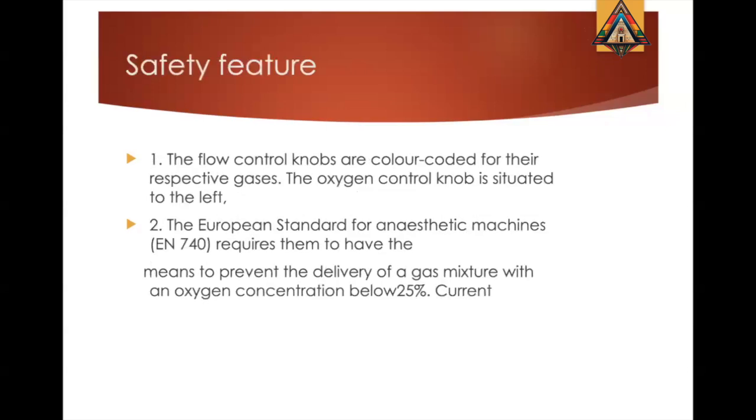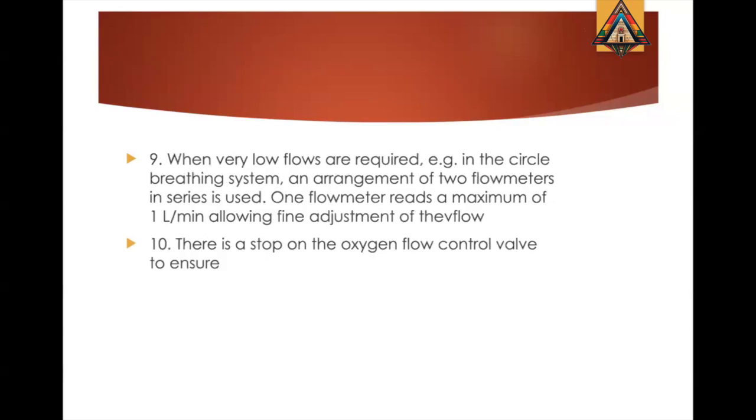The safety features, as we mentioned: they're color-coded, they're gas-specific, and they are calibrated. We have an anti-hypoxic system whereby under any circumstances, the oxygen concentration should be at least 25%. You cannot give 100% nitrous oxide because of the safety features. Whenever you raise the nitrous oxide, the oxygen will rise automatically with that.